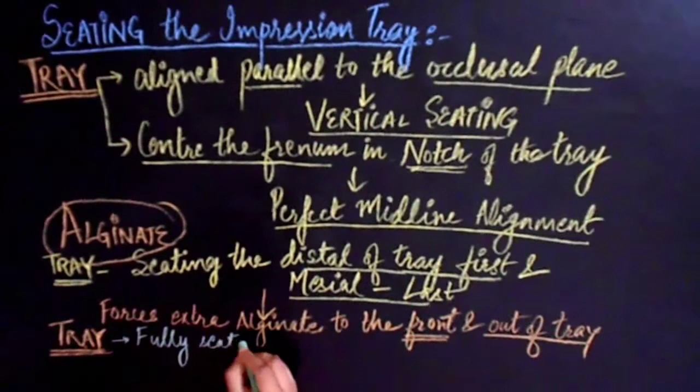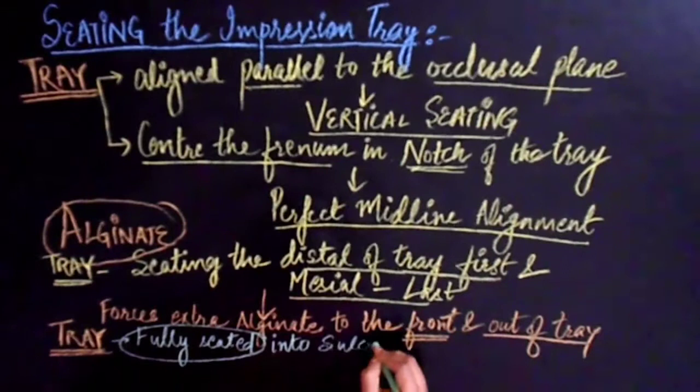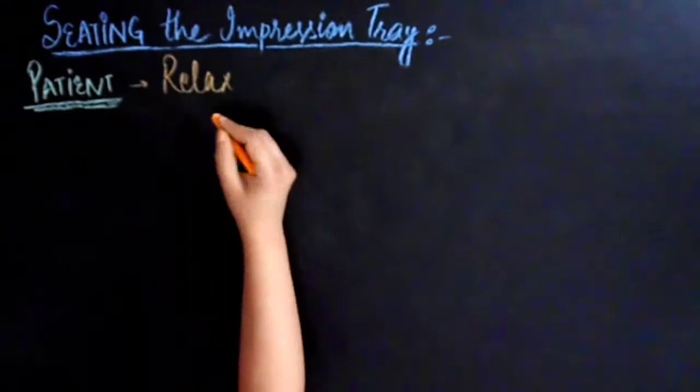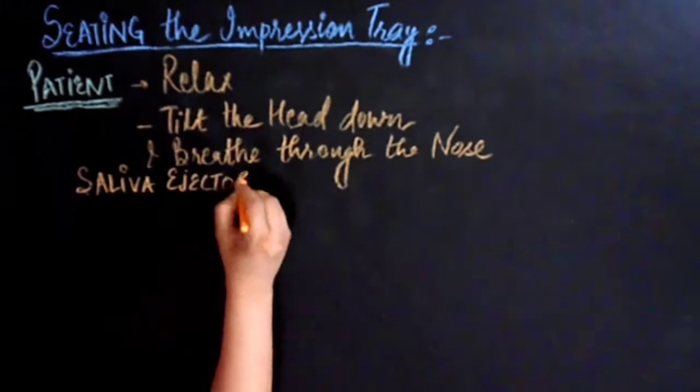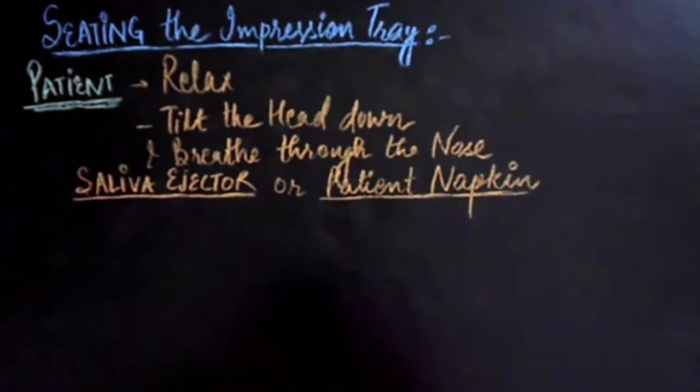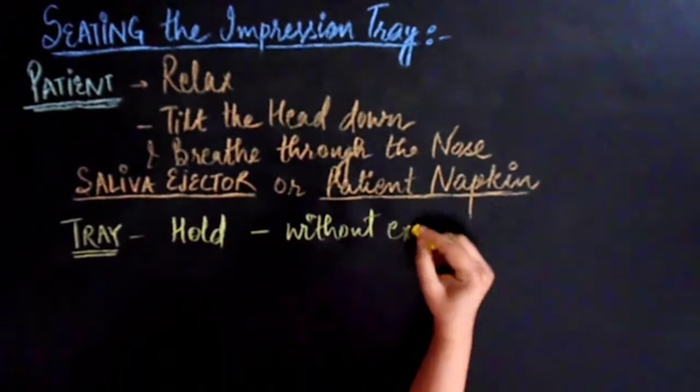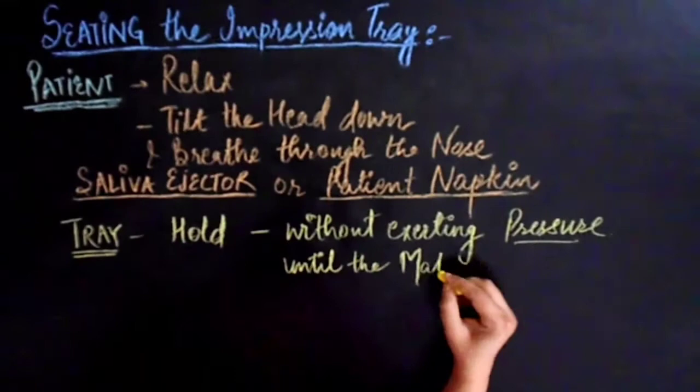If needed, use a mouth mirror to remove the excess and ensure that the tray is fully seated into the sulcus and not traumatic to the soft tissues. Make sure your patient is relaxed and tilt the head downwards. Ask the patient to breathe through the nose as the material is setting up. A saliva ejector or patient napkin should be in place to catch any excess saliva while the alginate is setting. Hold the tray passively in place without exerting pressure until the material is set.